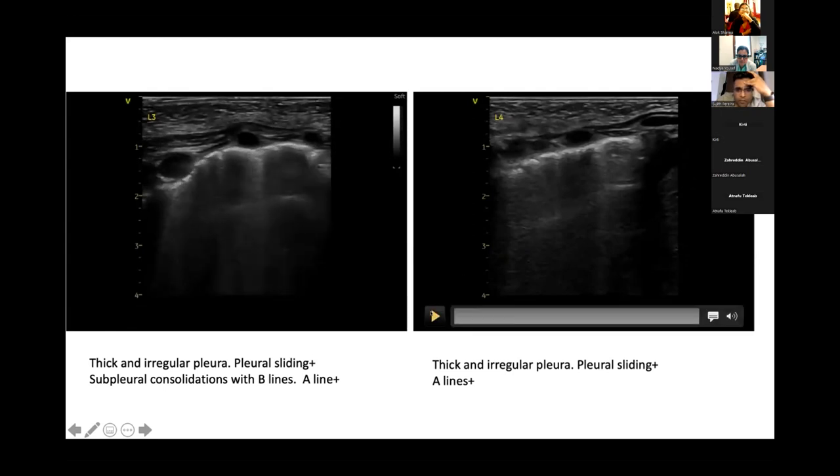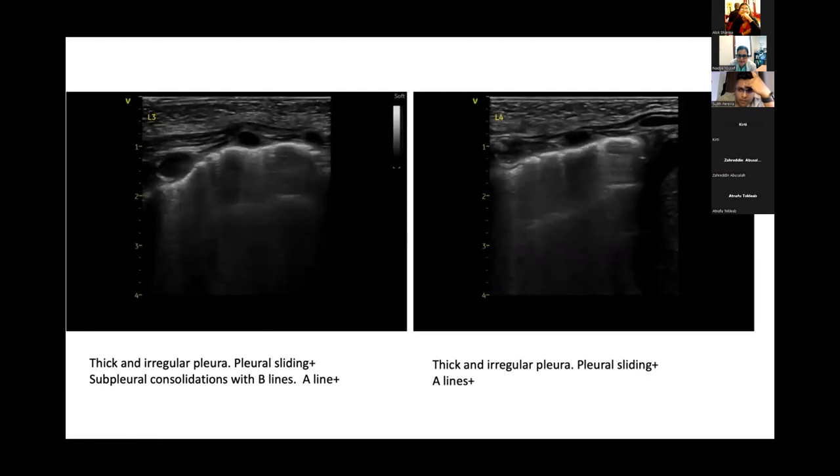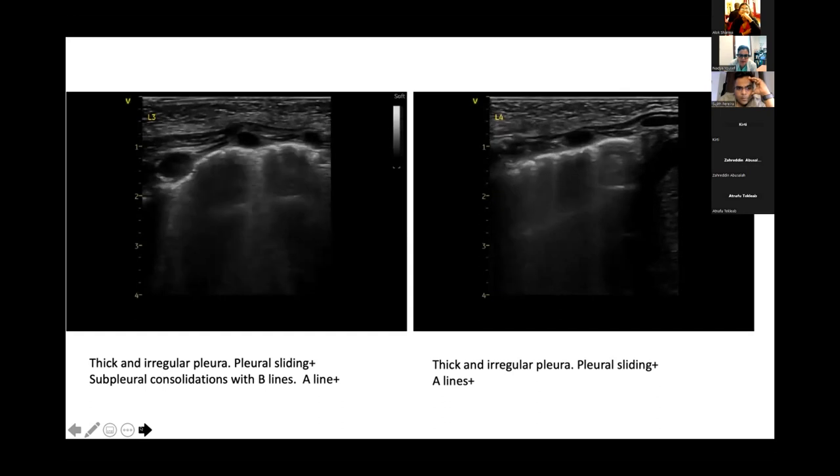But I agree with you. The B lines look more compact on the right side than on the left side. It's a different pattern. This is not a B profile because you've got a mixed pattern. You've got the thickened B lines going down, probably something to do with the septa and so forth. But on the right side, it's a complete B profile, except for maybe a few exceptions. So this doesn't really correspond with hemodynamic edema only, because you would expect them to be the same, but it allows you to see the difference. So yeah, very interesting case. Thank you very much for that.